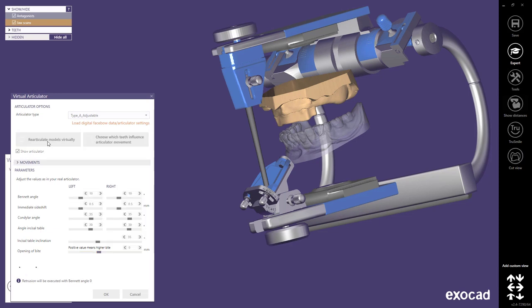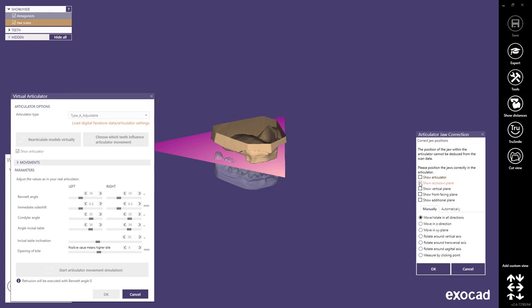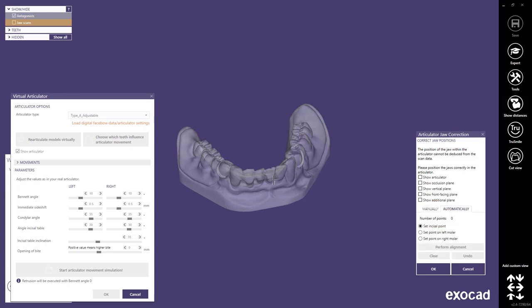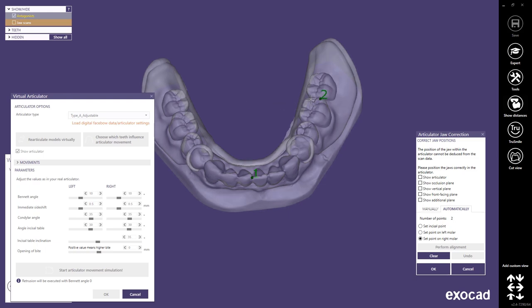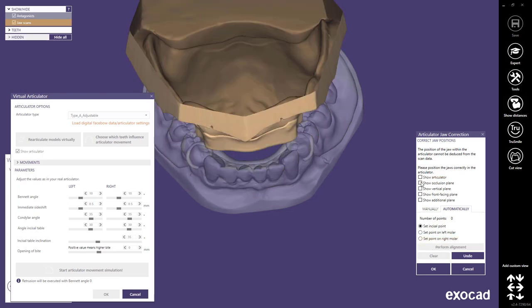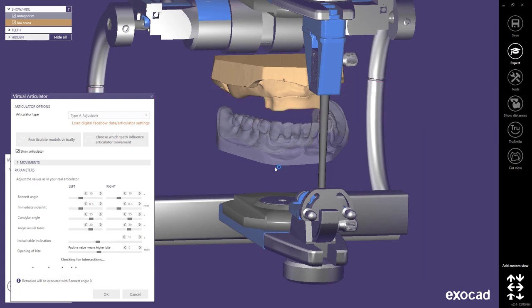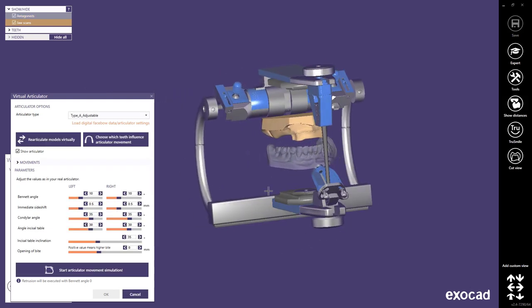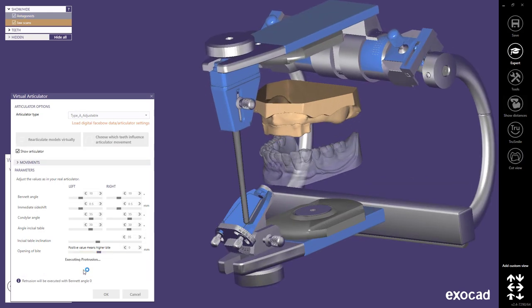You can click re-articulate models virtually if it doesn't fit. You can manually move the models or rotate them, but there's also an option to automatically re-articulate them. For this, simply select automatically and then click on the three selected points on your models. After ok they will be re-articulated. Always remember to press ok in the right side articulator jaw correction dialog first, or the new position will not be taken into account for your virtual articulator movement. If you now press start articulator movement simulation you will see the new movements in your articulator being applied to your models.